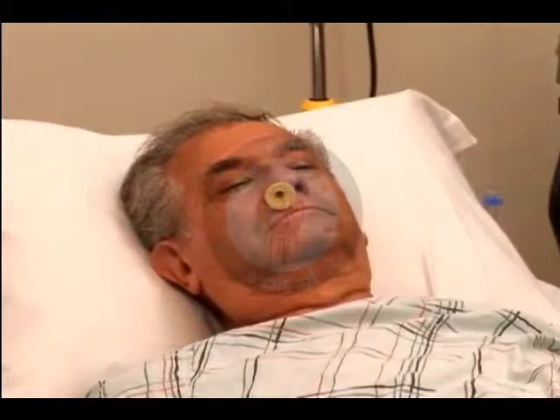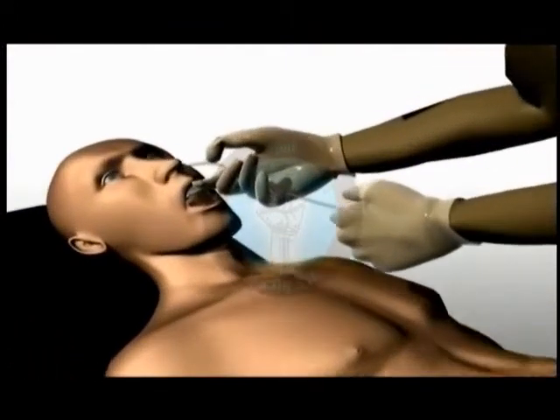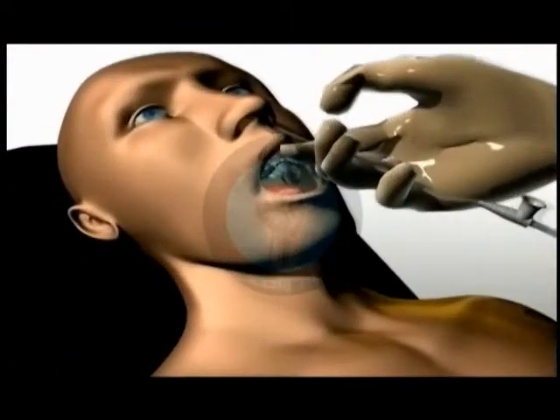Nasotracheal suctioning can be done every 2 to 4 hours on patients with respiratory distress, pneumonia, or moderate to severe weakness. Nasotracheal suctioning is performed to suction out secretions when the patient is too weak to cough up secretions on their own. The suction catheter is inserted into the nares and continues down the trachea to suction out unwanted secretions.